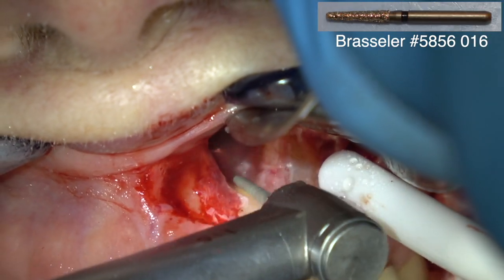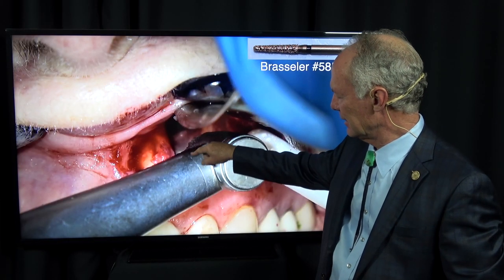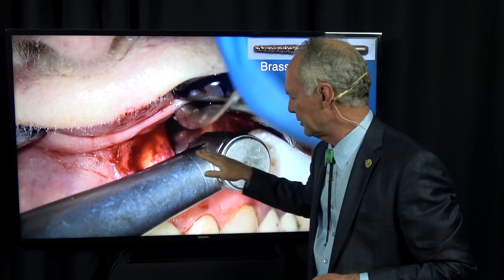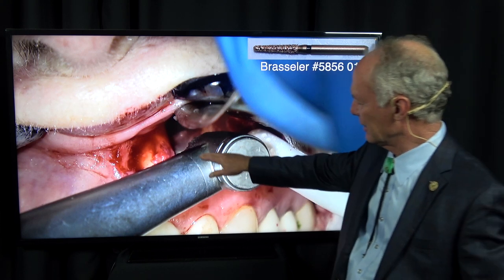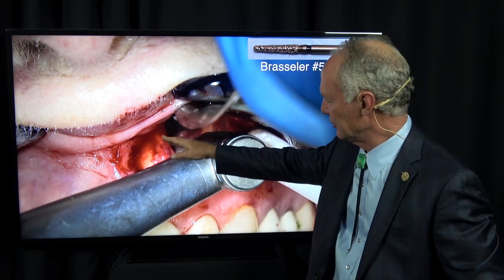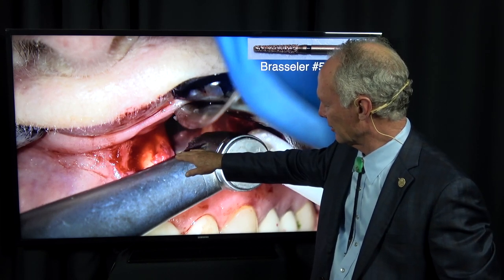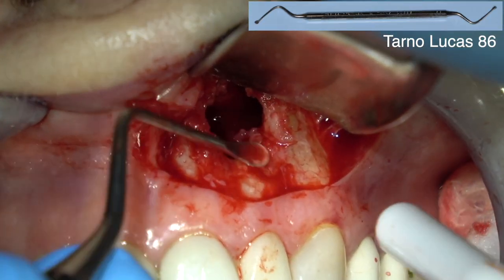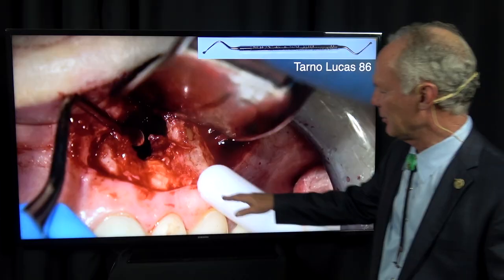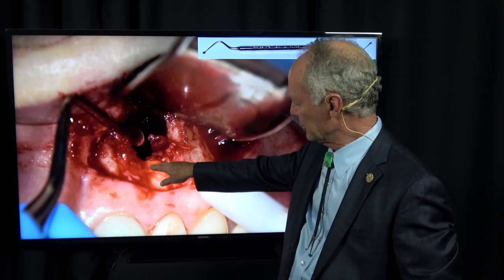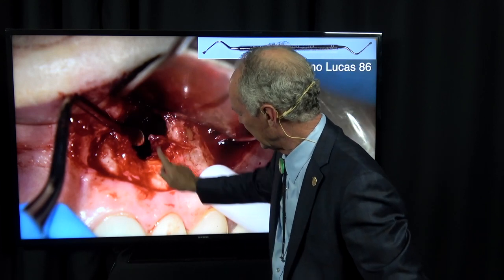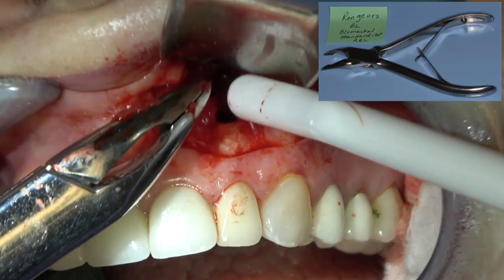Making a little more access. In a perfect world, you want to cut this back so you've got direct access to the coronal part of the granuloma. If it's tucked in under part of that root, it's sometimes hard to curette that out. So keep from cutting too much of the root off — cut the root back to the coronal part of the extent of the granuloma so you have direct access to the top part. If you have to go in behind that root with the spoon it's harder to get all of it out.